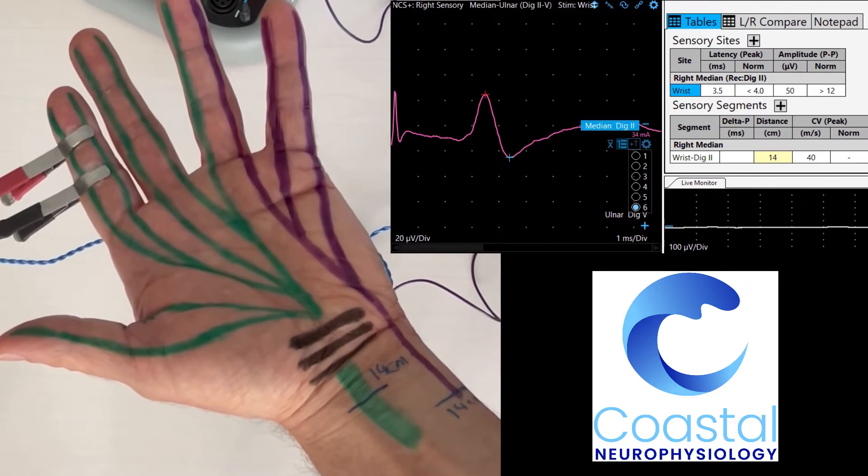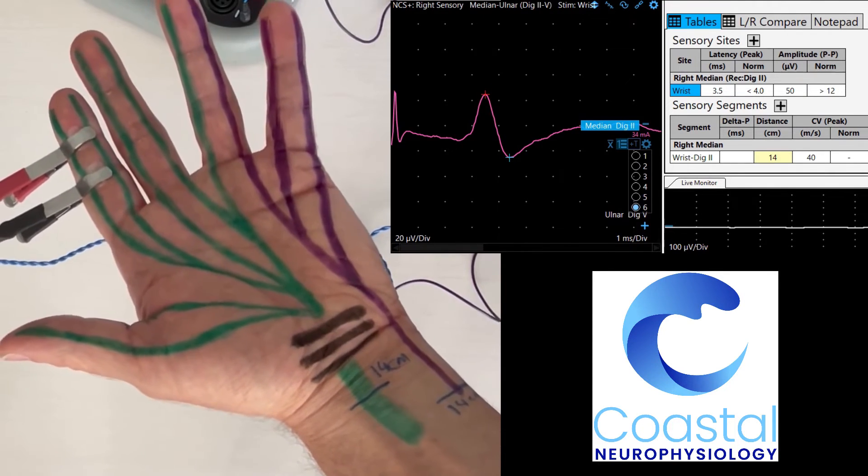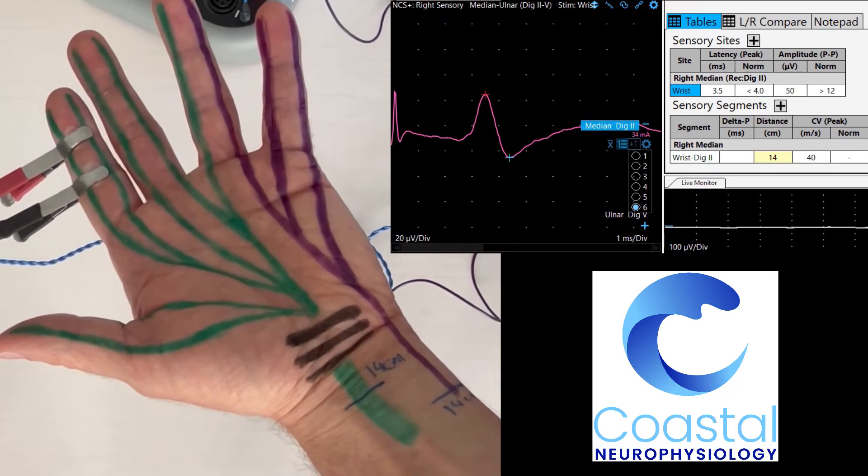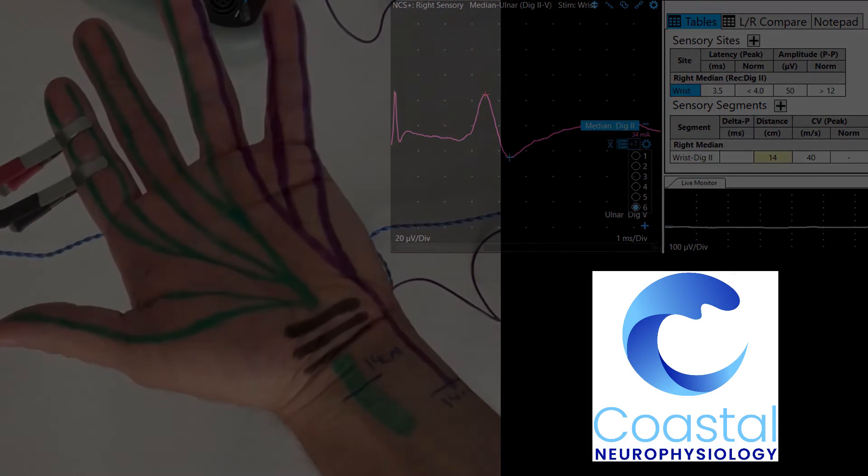So that signal, even though electrically very small, is technically normal for this nerve. The time it took the signal to get from my wrist to my finger, 3.5 milliseconds, was also normal.